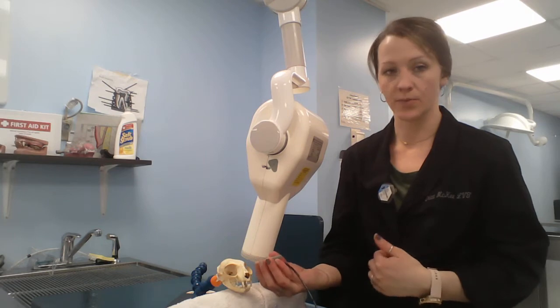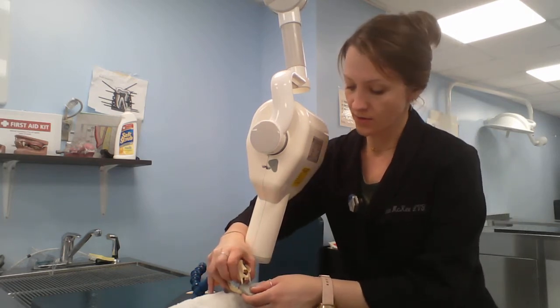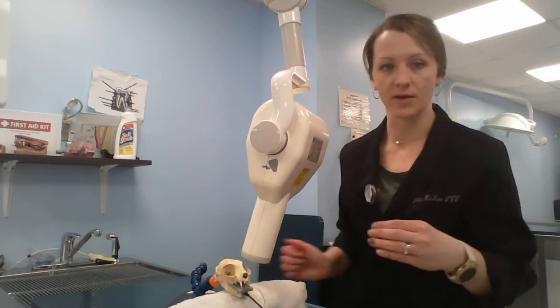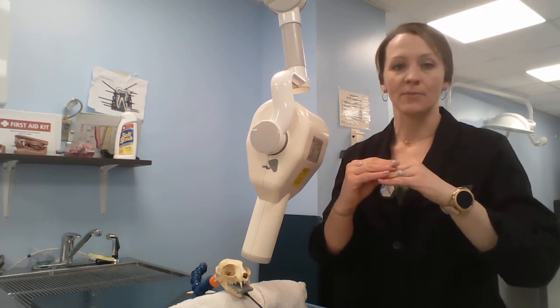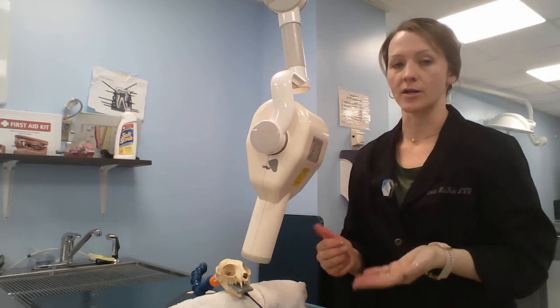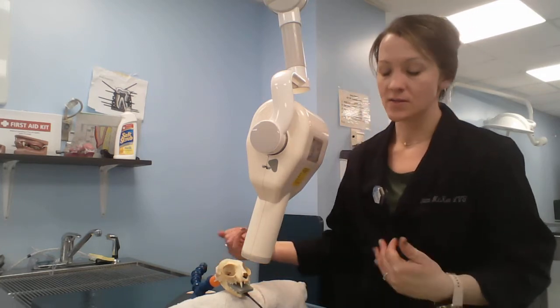Your digital sensor, you're going to start with the flat side facing up. So we're going to start with the upper jaw first. We're going to insert the sensor into the mouth and basically place it like he's biting on a sandwich. That's how I remember it. When we do the bottom jaw, you'll see the opposite. We'll roll him on his back and flip the sensor over so that the flat part is facing the bottom jaw.